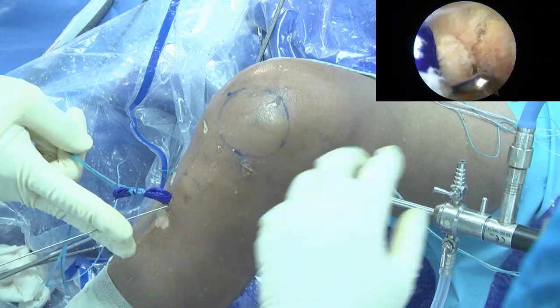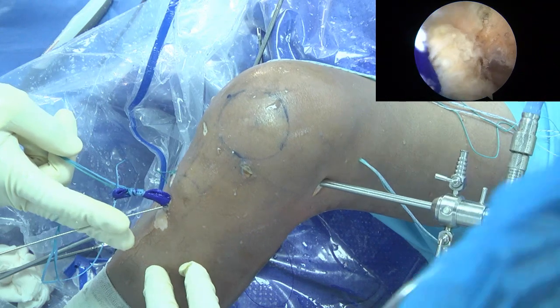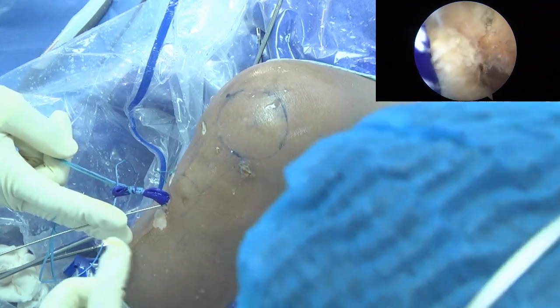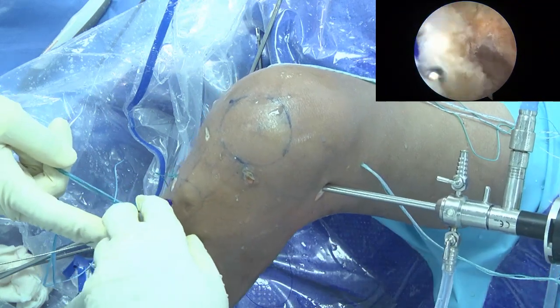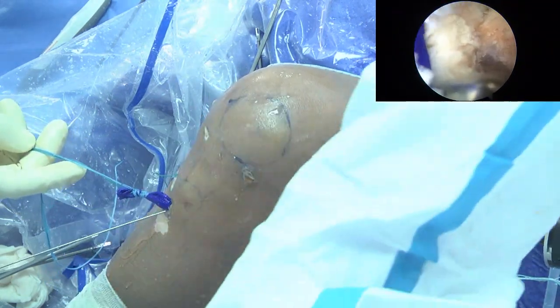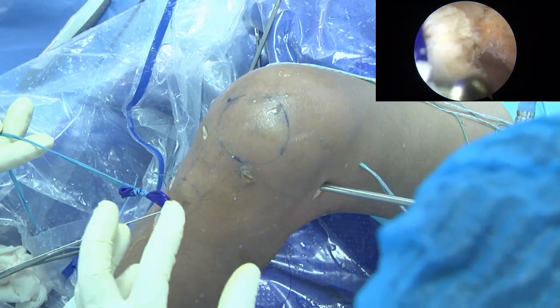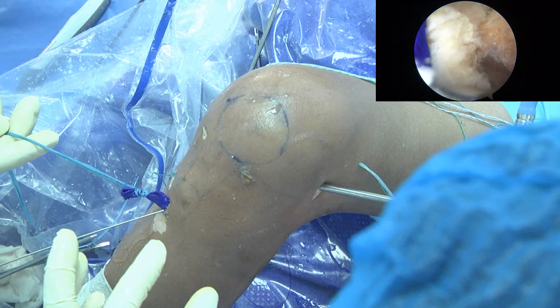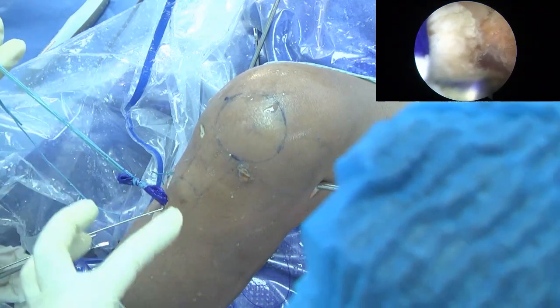If you have the long one, we prefer the big size screw and the longest screw. The longest screw, if you have, this is 35, right? I always use the 11 or 12 by 35. Big size screw, very strong. I also prefer to put my screw close to the joint because you eliminate the effect of the killer turn. It's like you do inlay surgery. Because if you put it close to this cortex, you still have gap moving inside the tunnel.